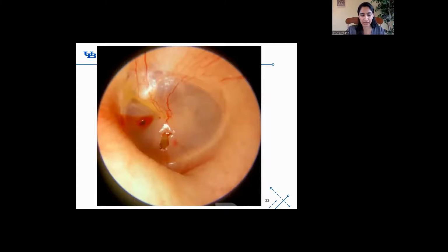So which ear are we looking at? Left ear. Yeah, this is the left ear. And what do we see that's abnormal? He has a perf. Yeah, would you be able to describe which quadrant we see this perf? It's like in the left lower quadrant. So if these are the approximate boundaries of the anterior superior quadrant, which one would this be below it? Anterior inferior. Nice job.